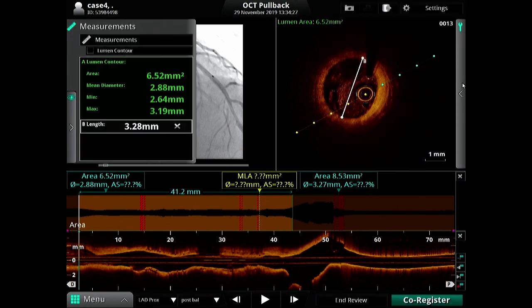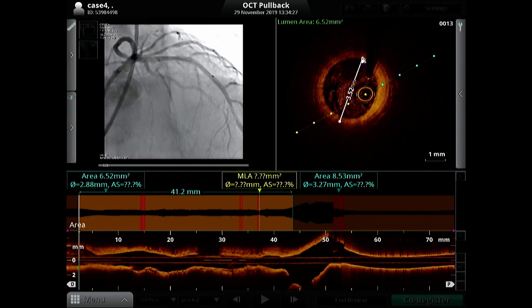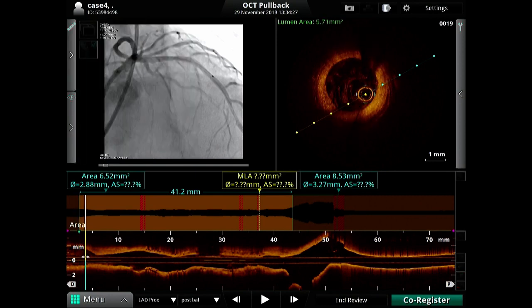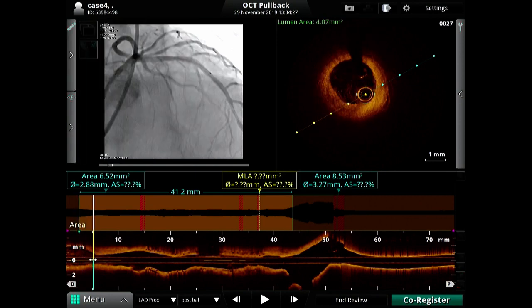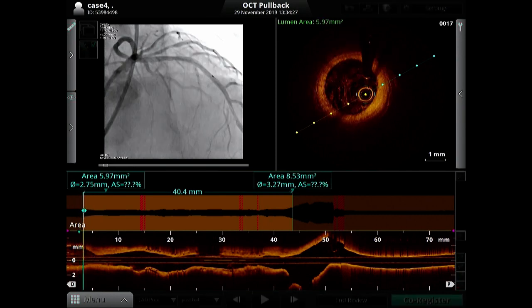to cover the normal to normal. I recommend you implant 3.25. Do we require two stents or one stent? Distal two stents, and then add an additional stent at 3.5. I wanted to implant 38, it's too short. 38 will do. Okay.